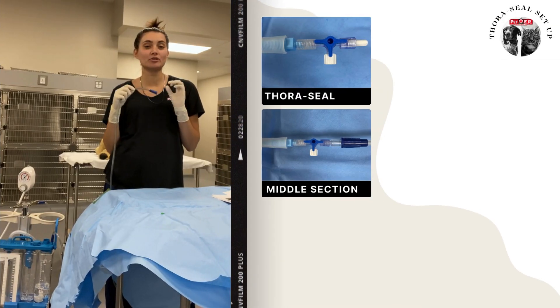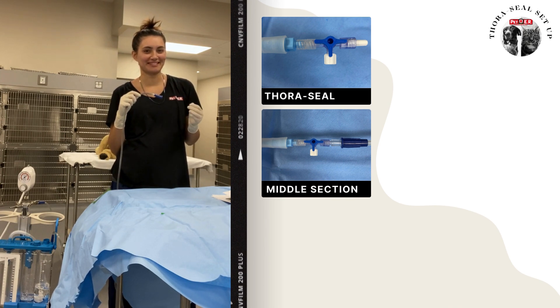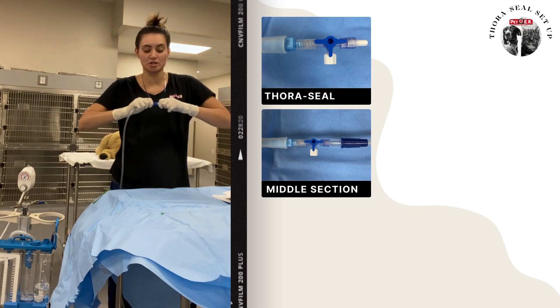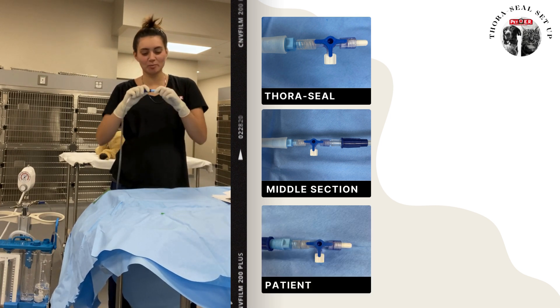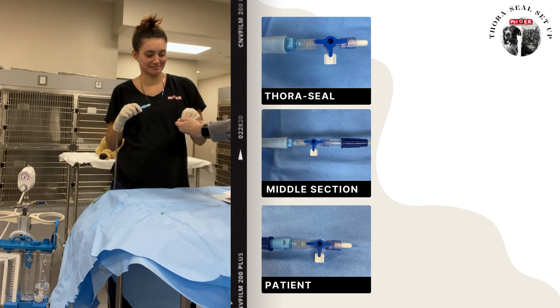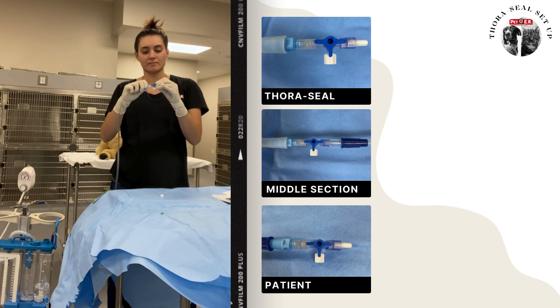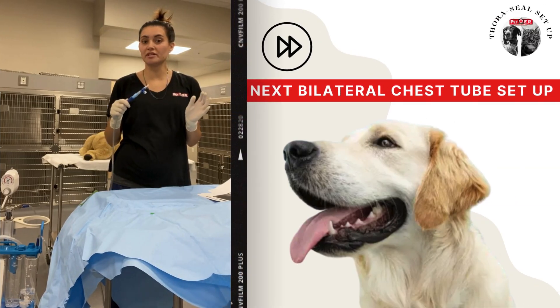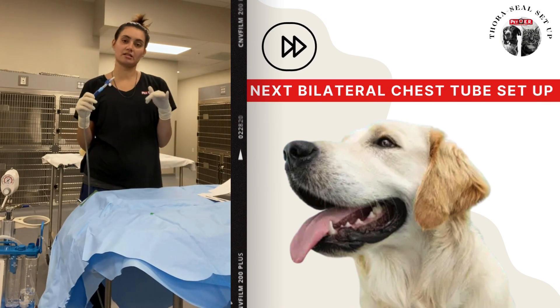Now your buddy is specifically going to hand you a male Christmas tree. You're going to put that in that end, and then they're going to sterilely hand you another stopcock. That's going to go on the female end of your stopcock, and you're going to leave your cap on because this end is what's going to hook up to your patient's chest. If we're only doing one chest tube, you're completely done — you would hook this up to your patient and turn your Thoraseal on.